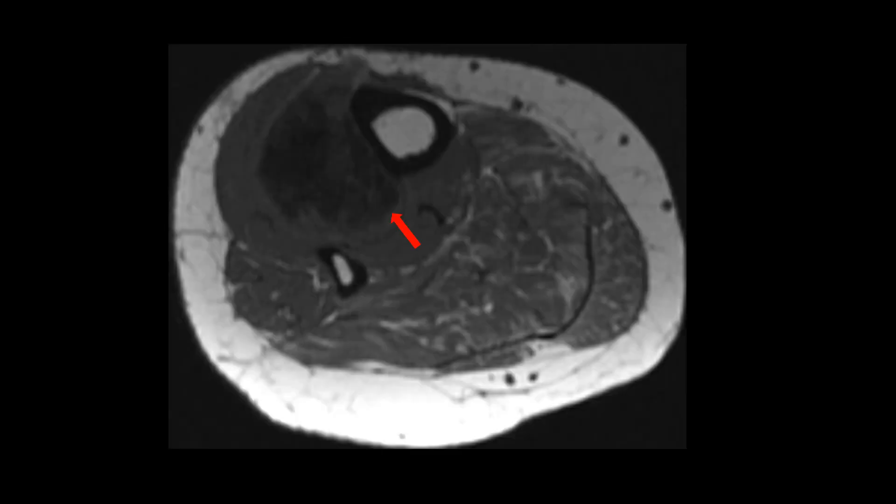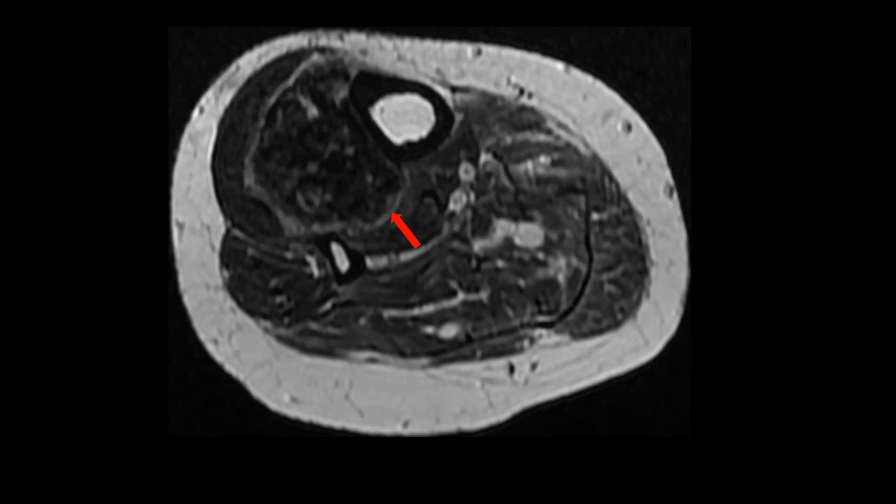On this axial T1-weighted image, we see that this lesion is hypointense with intact adjacent cortex, suggesting that this lesion arises from the outer periosteal layer of the tibial diaphysis. On axial T2-weighted image also, this lesion is hypointense with intact cortex and there is no obvious adjacent marrow involvement.